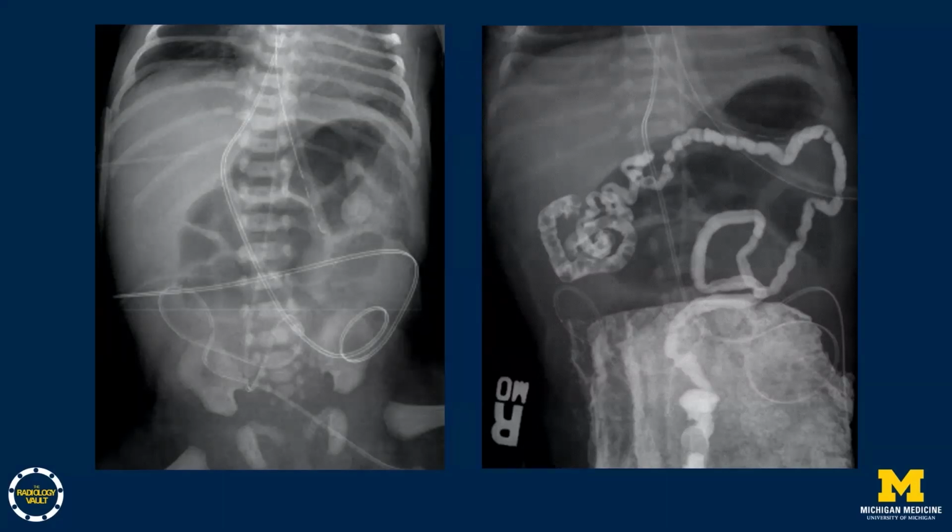Now, keep in mind, we have not refluxed the contrast into the dilated air-filled loops of bowel on the radiograph. So we may have a complicated meconium ileus, and it is worth trying to reflux back into the dilated loops if possible, but doing so safely.